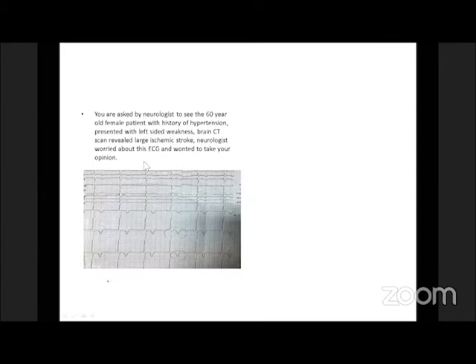The patient has a neurological insult, so this is not related to a cardiac origin. It is probably cerebral T wave inversion secondary to hormonal changes, and it is commonly found in patients with large ischemic stroke or hemorrhagic stroke.